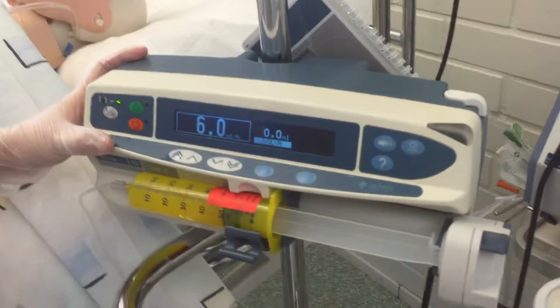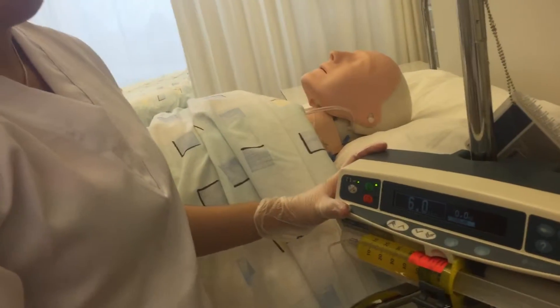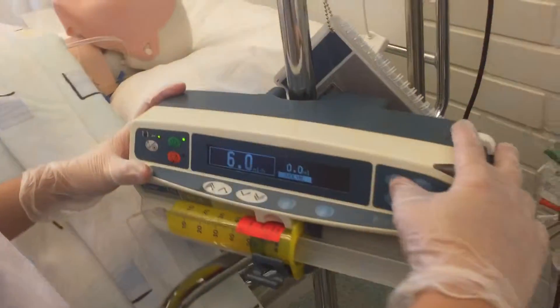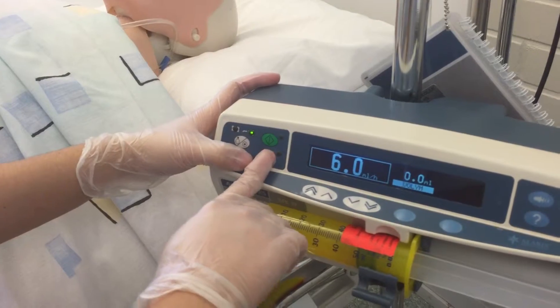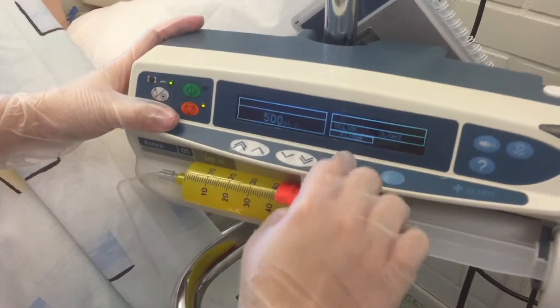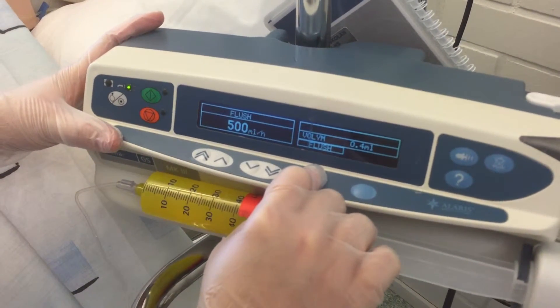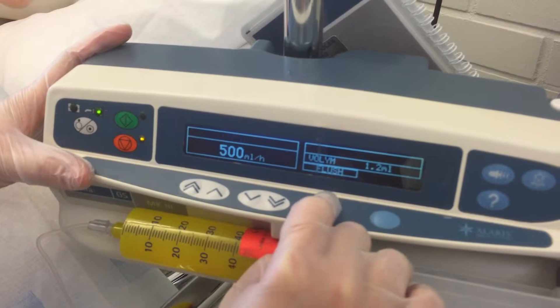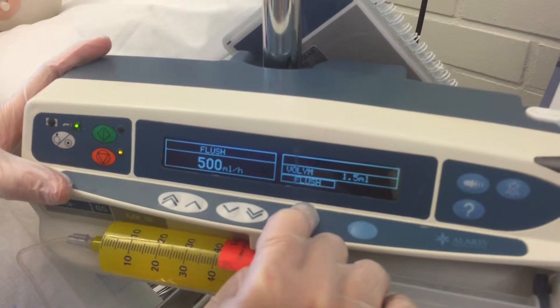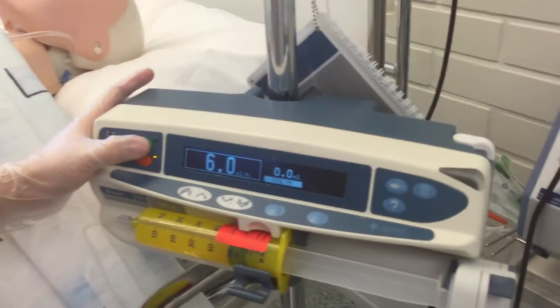Since the patient is still complaining of pain at VAS 7, you can give a bolus of 2 mL. Press stop, then press the bolus button to start giving the 2 mL bolus. Now it's done, then press it again.